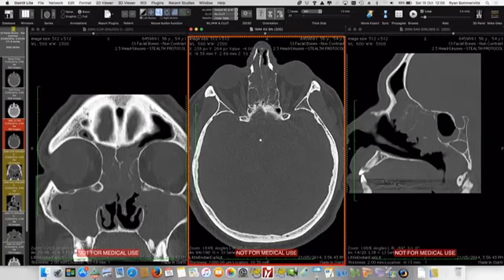We tend to use all three images, like Jen said, all three slices, when we're preoperatively planning, trying to create a 3D picture in the head. Medically, legally, we have to have the scans up either on the computer or on the wall, because if there's a problem, then you can't say you're doing it very well if you don't have the scans available.